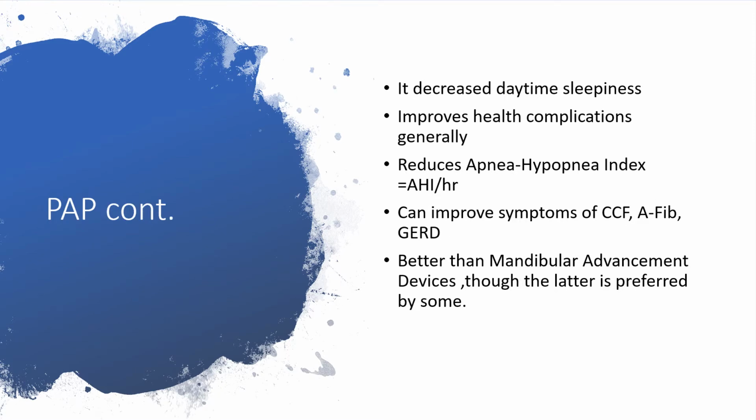Positive airway pressure will decrease daytime sleepiness, will improve health complications generally, will reduce apnea-hypopnea index per hour, and will probably improve symptoms of congestive cardiac failure, atrial fibrillation, or gastroesophageal reflux disease. It is better than mandibular advancement devices, though some may prefer the mandibular advancement devices.